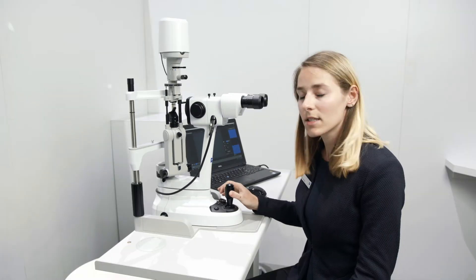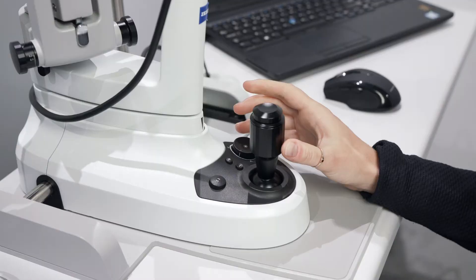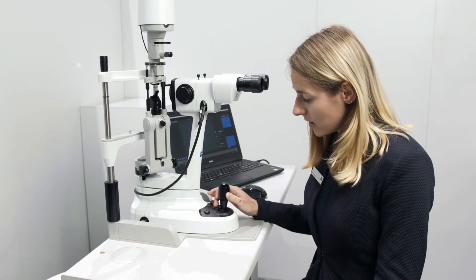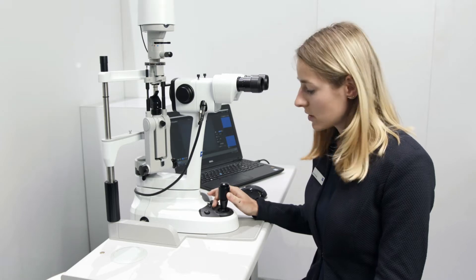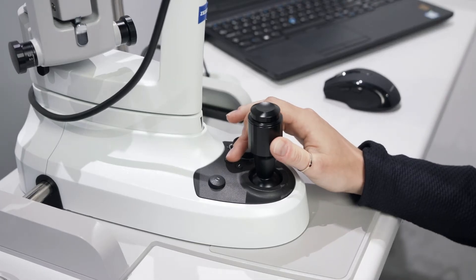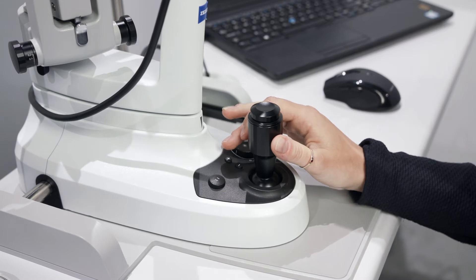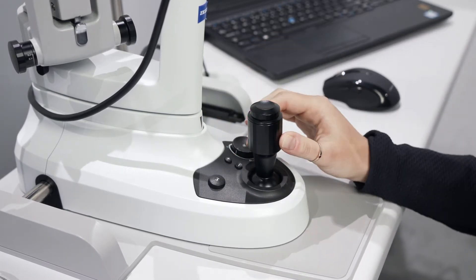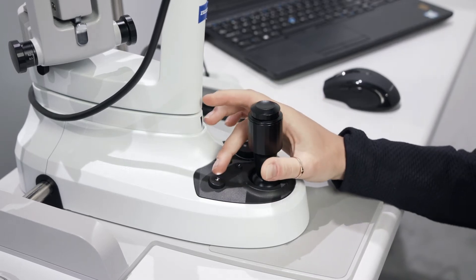You can control the slit lamp or most important functions with one hand, so the illumination can be controlled here. We now have our so-called auto-view — it's a motorized magnification changer. If you want to manipulate something on the eye and you need the device not to move, then use the quick action brake, our so-called quick stop.